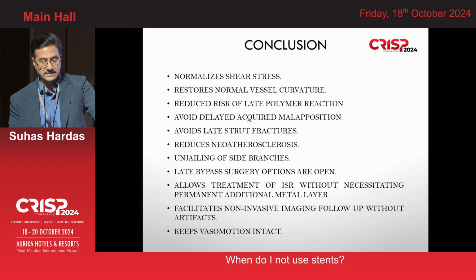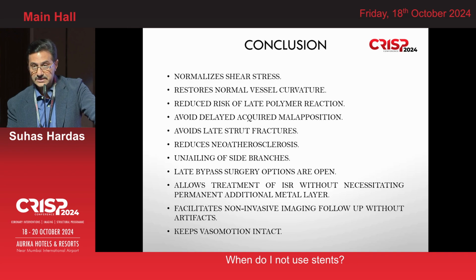Avoids late strut fractures, reduces neoatherosclerosis, unjailing of the side branches. Late bypass surgery options are open, allows treatment of ISR without necessitating the permanent additional metal layer, facilitates non-invasive imaging follow-up without artifacts, and keeps the vasomotion intact. But we need more evidence in favor of this.